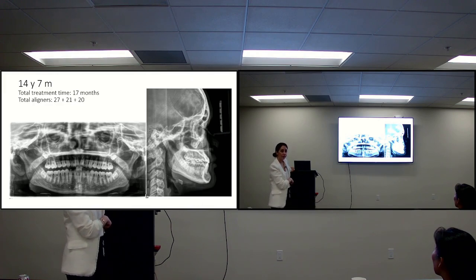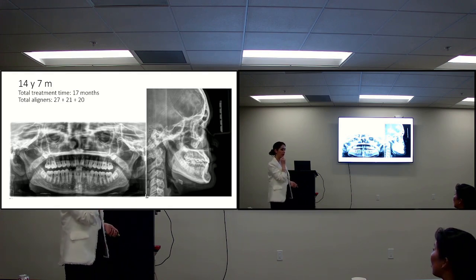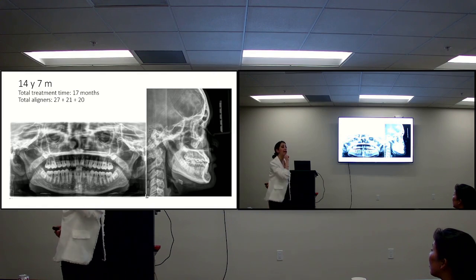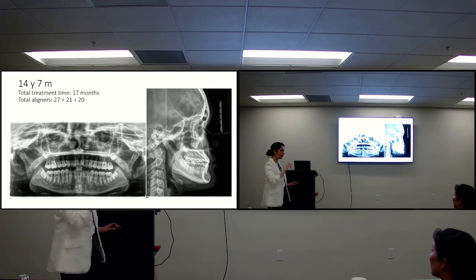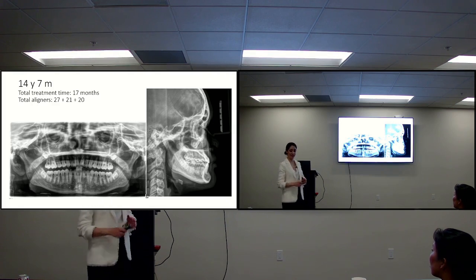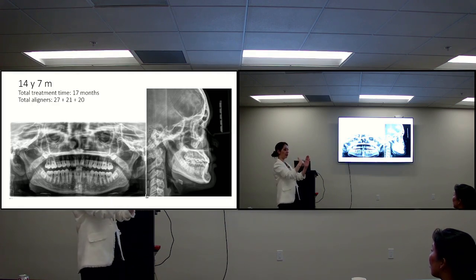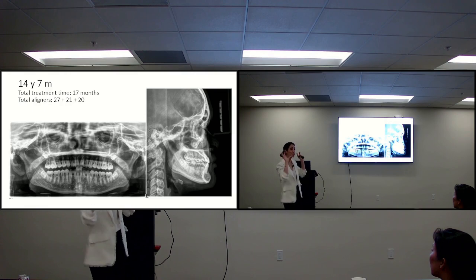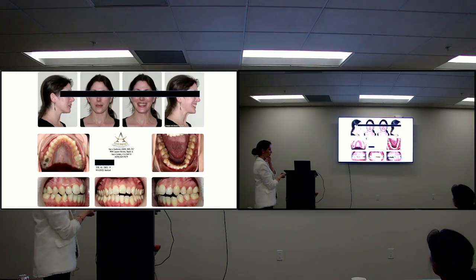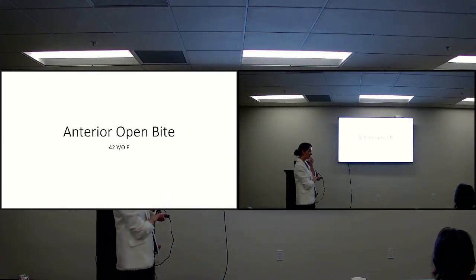In her case, was she a pseudo class 3? She was, actually. She was edge to edge, and that's key. So what Mike's talking about is if you take the patient, tell them, okay, relax your jaw, let me close your teeth together. When she bites, she's actually edge to edge. If you tell somebody to bite, and if you tell them to relax, and they're still biting like this, that's a surgical case. Do you know what I mean? You tell them to bite, and then they just don't go back. They have like 5 millimeter reverse overjet with no CR-CO shift. And they have no crowding of the upper, everything's just so straight. They have this massive anterior crossbite. That's a surgical case. Yeah, that's the case I sent to my friend that you're doing.